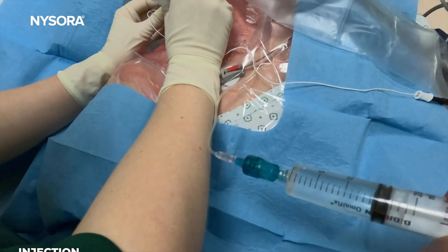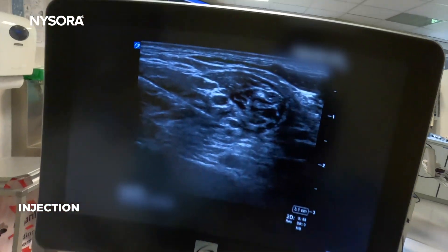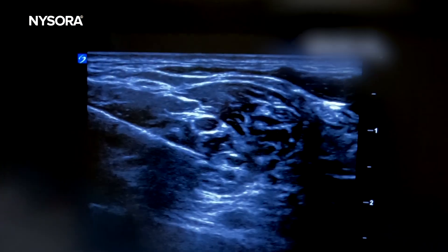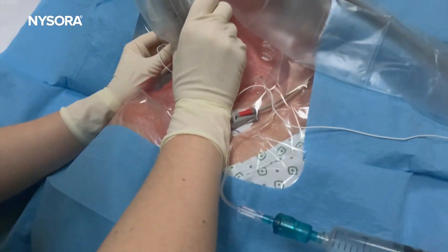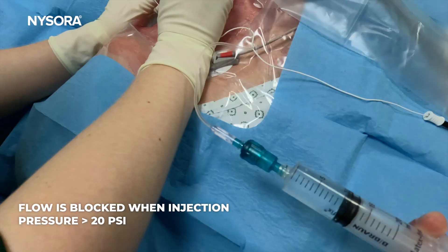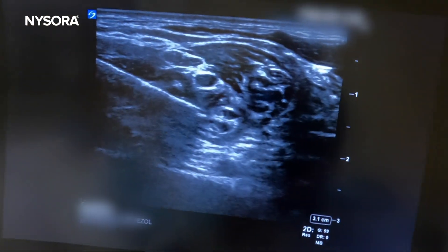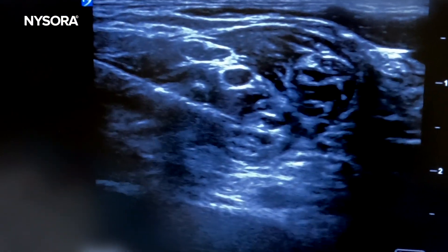Aspiration is negative and injection is possible using the nerve guard at pressures less than 20 psi. Otherwise, if the pressure were to exceed 20 psi, the device would simply stop the passage of the local anesthetic, effectively preventing an injection with pressure over 20 psi.